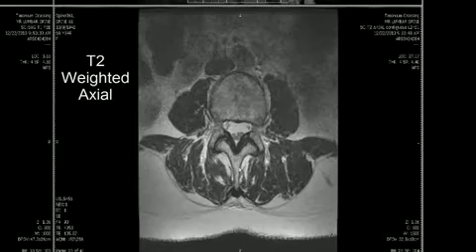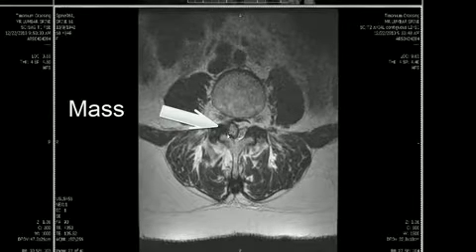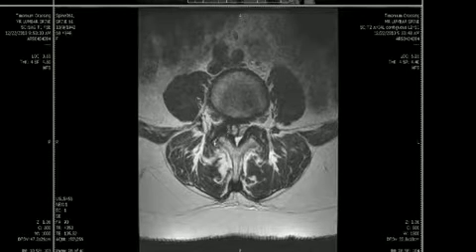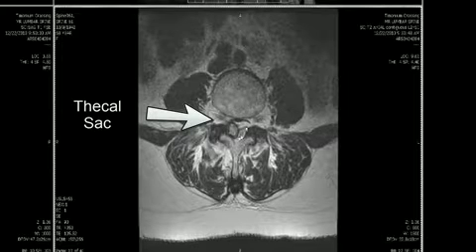On this axial T2-weighted scan through the representative level, we see a mass which again has bright signal intensity centrally but a low signal intensity periphery. It is intimately associated with the facet joint, which itself shows moderate degenerative changes with spurring posteriorly. There also appears to be thickening and hypertrophy of the ligamentum flavum. This mass is compressing the thecal sac, and the nerve roots within the thecal sac are compressed on the right side.